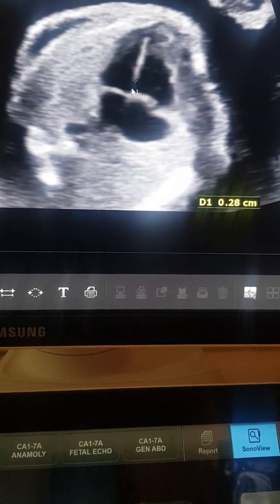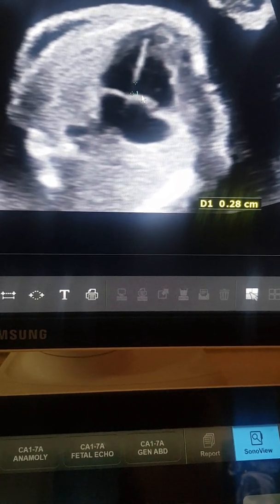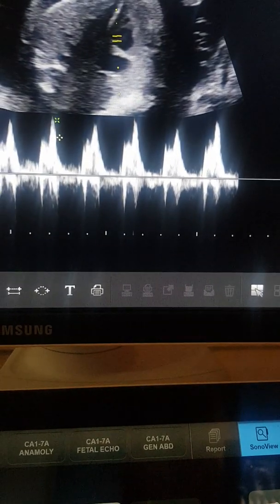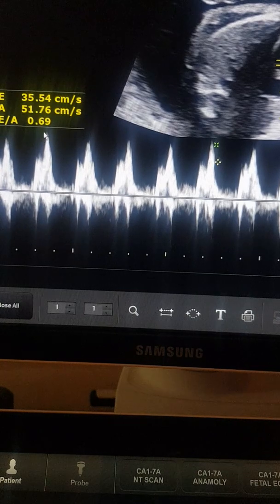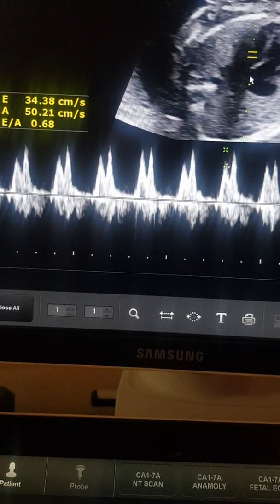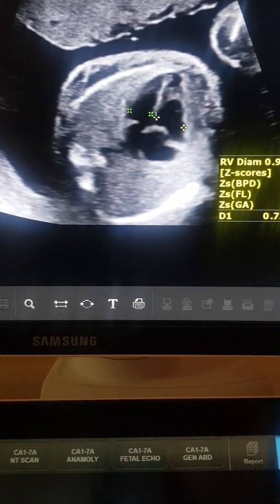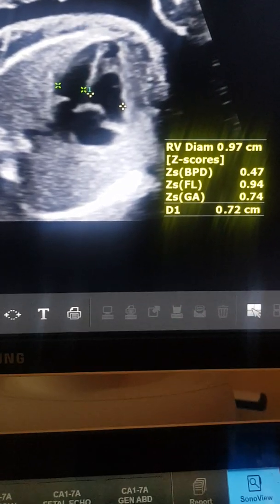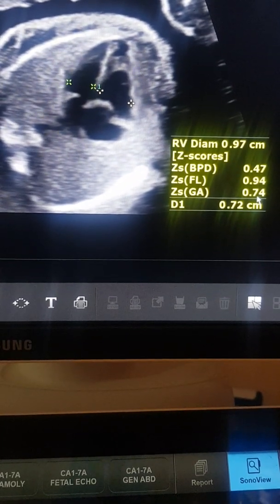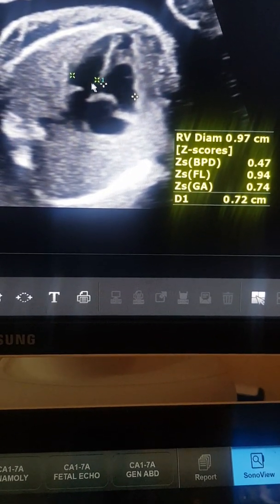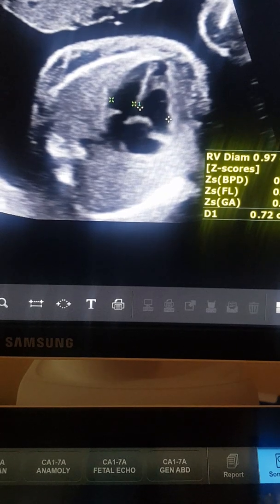There is a large void or anechoic area in the region of the membranous interventricular septum, and I am not sure whether it's a VSD or a dropout artifact. I go to do Doppler of the tricuspid valve, which shows a normal E/A ratio, then the mitral valve, which also shows a normal E/A ratio. Flows across the tricuspid and mitral valves are normal. The right ventricle diameter is 9.7 mm corresponding to a z-score of 0.7.